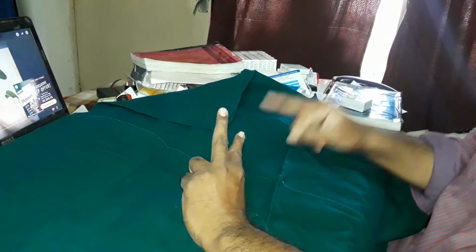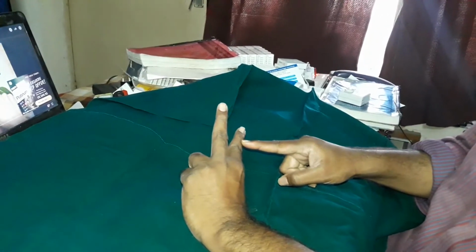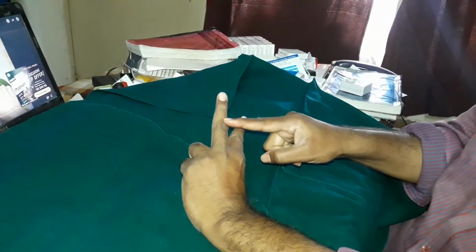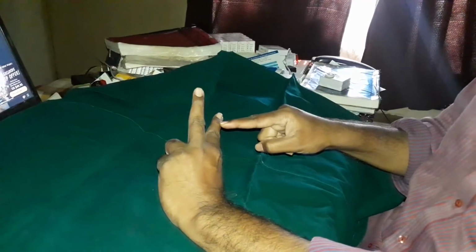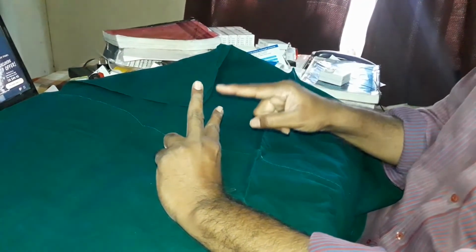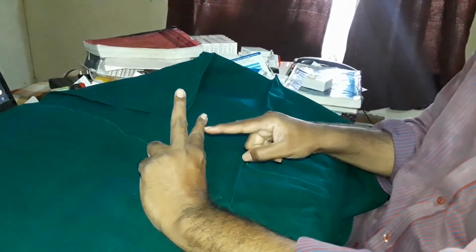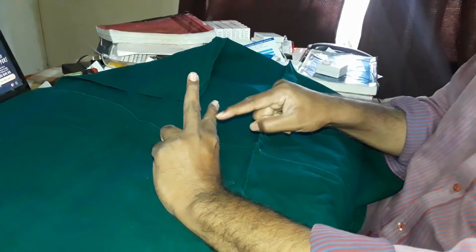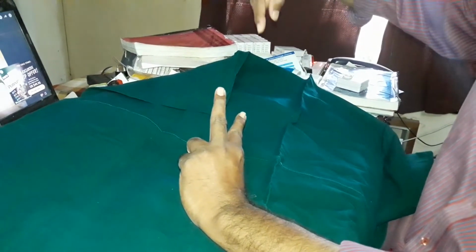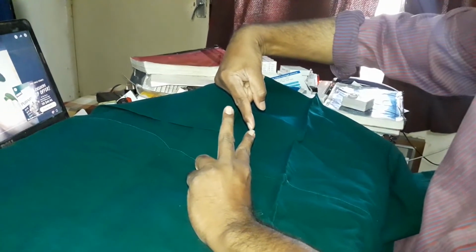anterolateral to the facial nerve. Now the point is, how aberrant the facial nerve may be, that means in abnormal facial nerve courses also, the chorda is always anterolateral to the facial nerve.